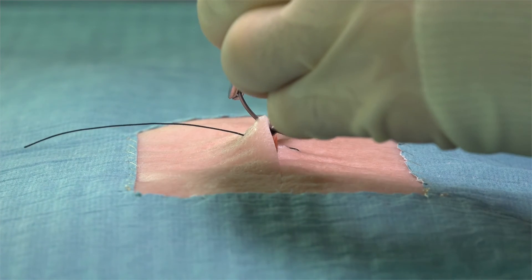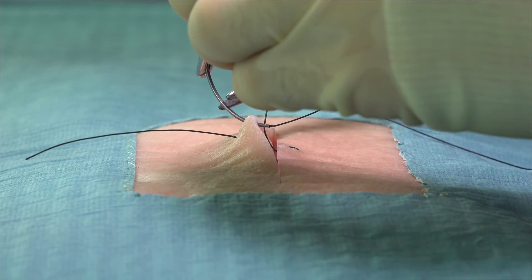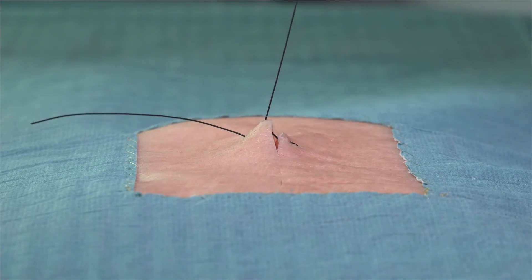If the smaller bites are too far away from the skin edge, the skin will not be nicely opposed and it can cause the wound to open up.